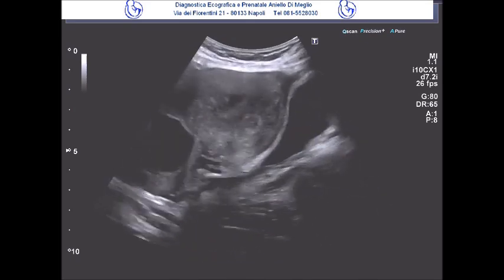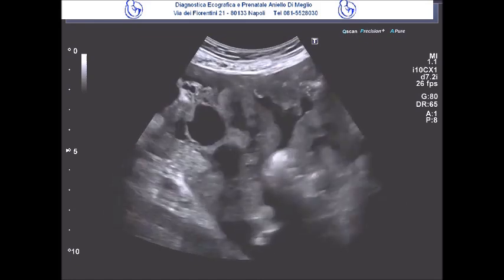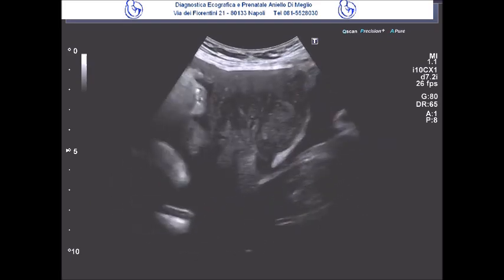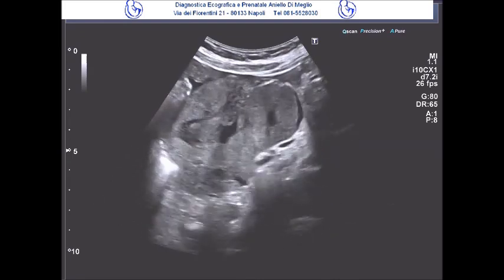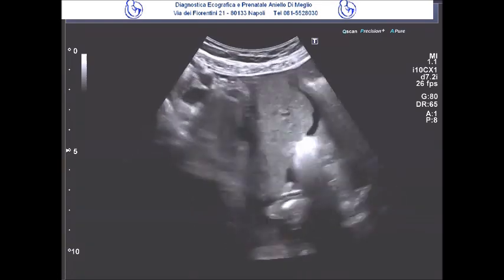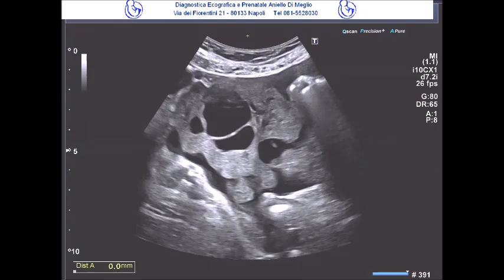Dear colleague, I wish to present to you a clinical case of an adnexal mass. We are dealing with a 50-year-old patient who is regularly menstruating, coming in for a routine checkup with no noteworthy symptoms. On abdominal pelvic examination, we can clearly see that both adnexa are completely disorganized. In fact, it is not possible to observe the normal differentiation or the typical appearance of the ovaries.